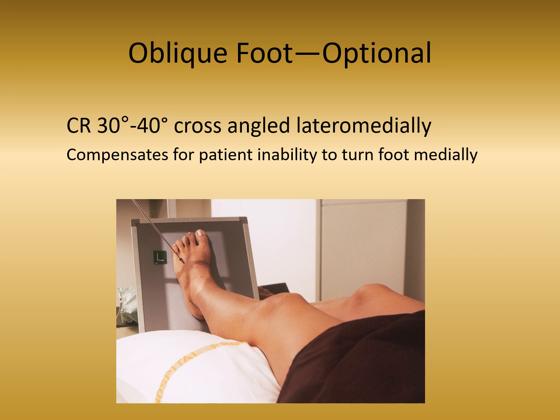Notice that the central ray enters the more lateral side of the foot here, and it's going to exit the more medial side of the foot here. Therefore, it gets the name of a lateral medial projection. So I just want to make sure that you understand why we call it a lateral medial projection, although it is not a lateral position. This is an adaptation of an oblique foot position because it is in a trauma situation. Patient cannot rotate the foot. We cross angle. We enter the more lateral side of the foot, exiting the medial side of the foot to ensure that we're projecting the entire foot and all of the metatarsals and all of the bones that we need onto our image receptor.